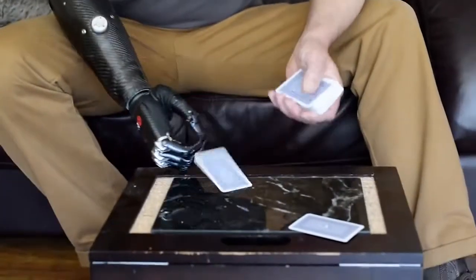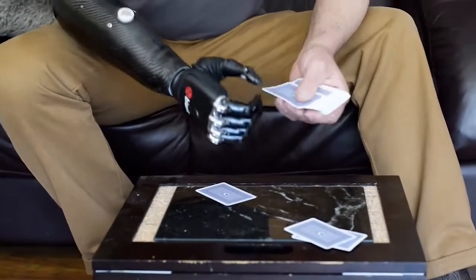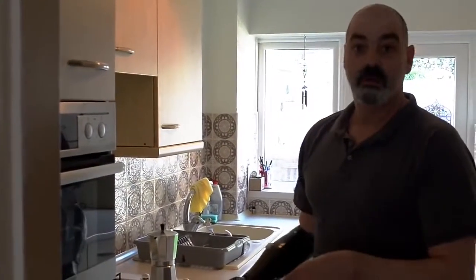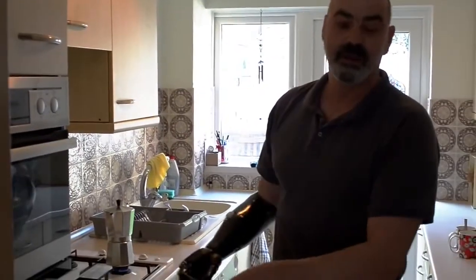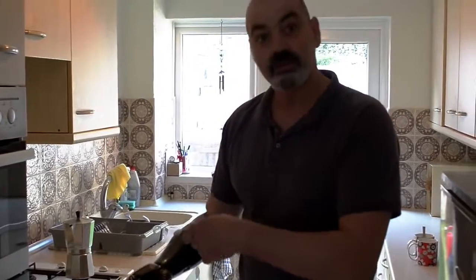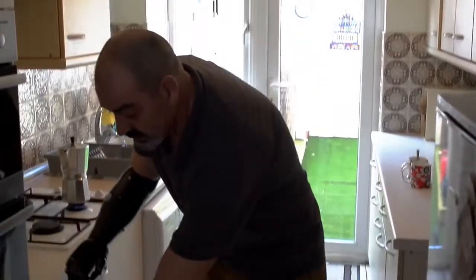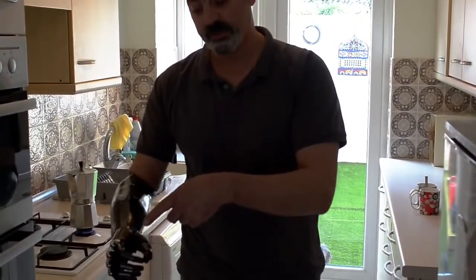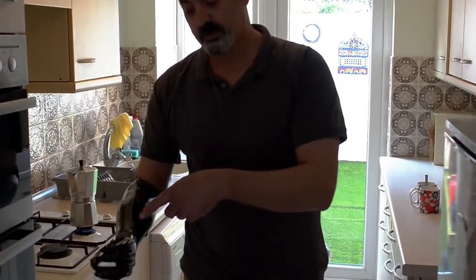The simple act of dealing cards, for example — that's something I can do. When I'm going to make a cup of coffee, my jug's in this cupboard, and there are little things. The wrist doesn't flex but it rotates, so what I tend to do is I've got the wrist deactivated — activate the wrist, spin the wrist.